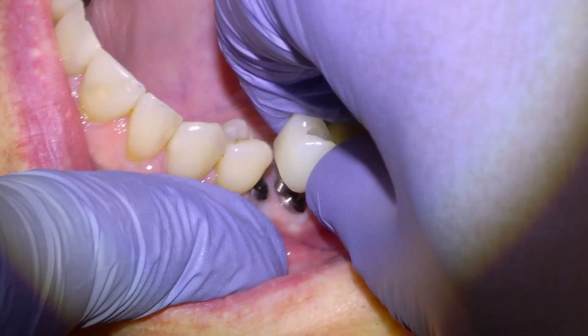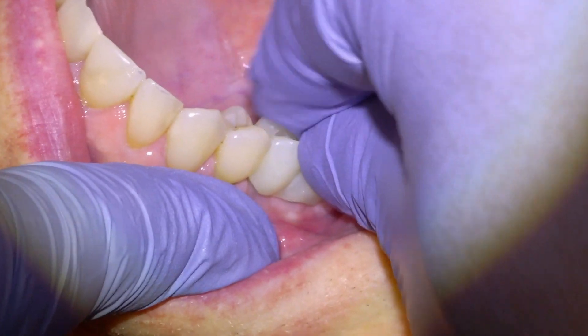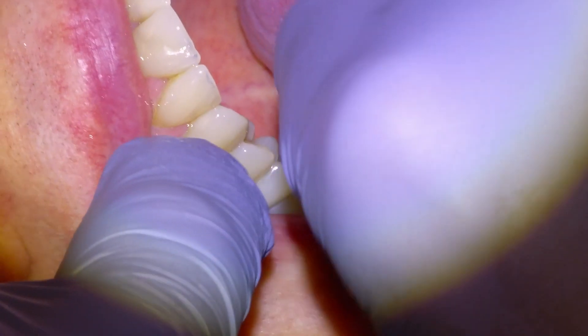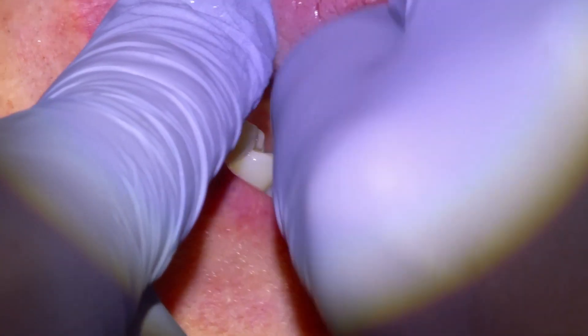We'll essentially just take our bridge, place it onto the implants, and screw it down. The next little bit is just going to be tightening down the bridge with this little finger driver first and then with our torque wrench.